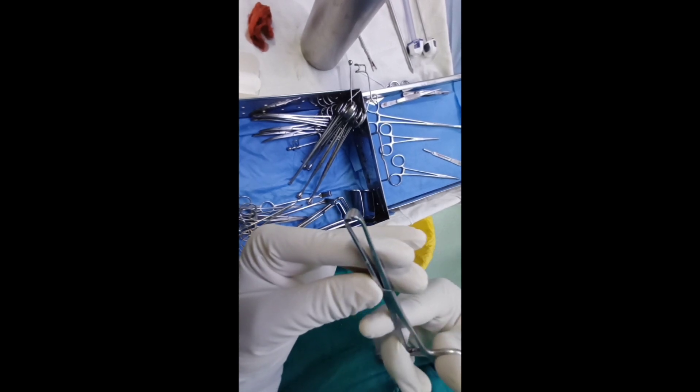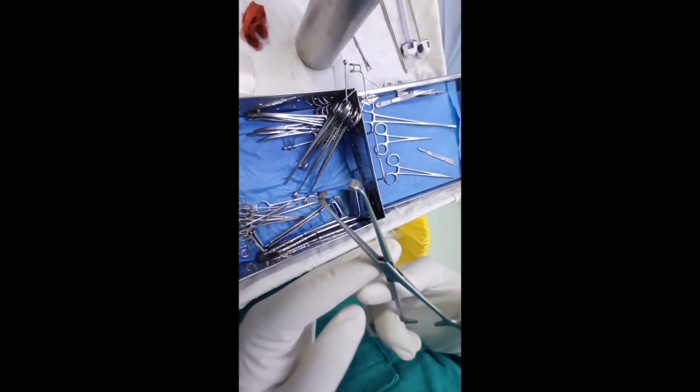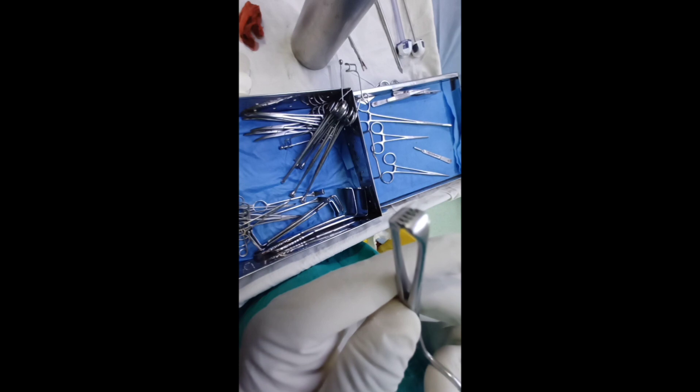Due to these teeth and serrations, it is traumatic. The method of sterilization is by autoclaving. It is used to hold structures like fascia and aponeurosis.